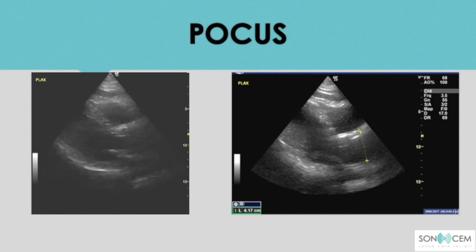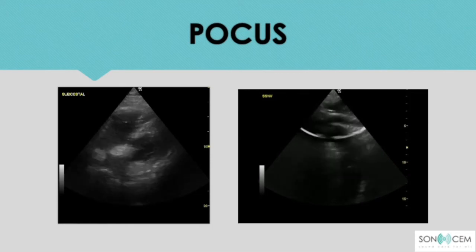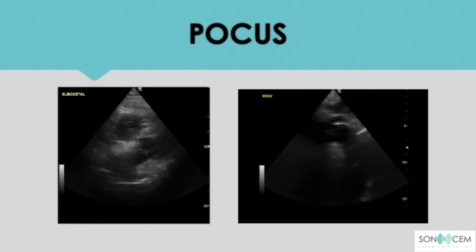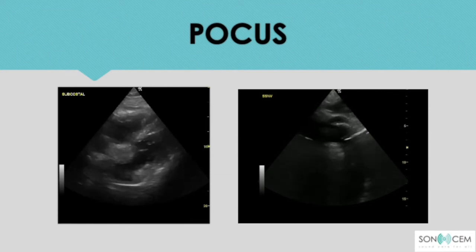You can see the ratio is not 1:1:1. The aortic root is bigger than the RV and LA. So, we measure the right side one, which shows 4.17 cm. Okay, from the subcostal four chamber view, there is pericardial effusion, but this is not in tamponade. And on the right side, if you look carefully at the descending aorta, there is a flap inside the descending aorta.